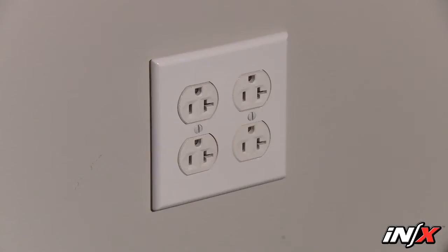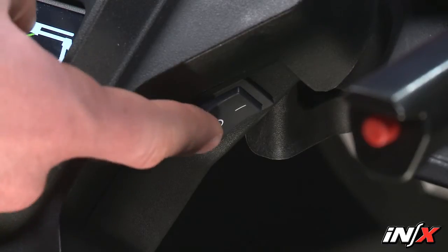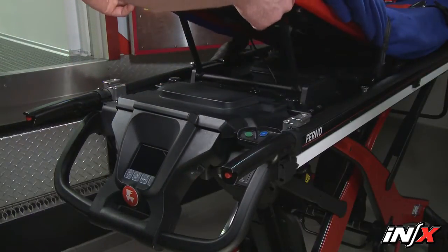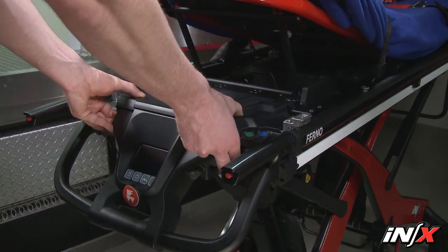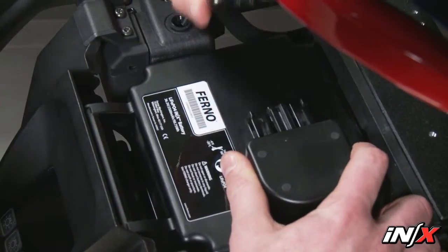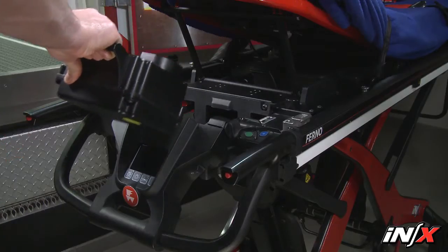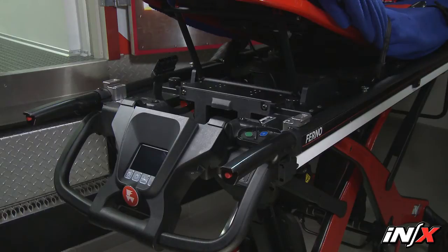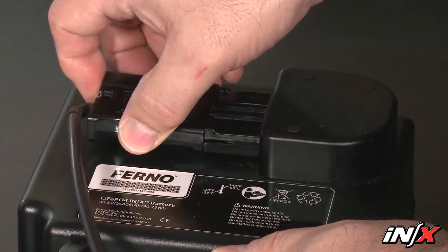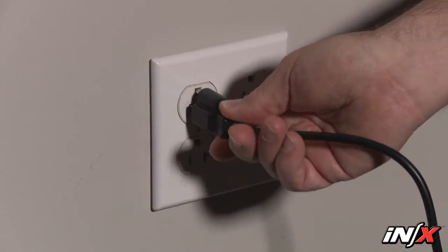To charge the battery through a household electric outlet, make sure the NX power switch is in the off position. Remove the battery from the NX by lifting the shock frame and removing the battery cover. Grasp the battery cable plug and disconnect the cable from the battery port. Use the battery carry handle to lift the battery up and away from the cradle, and connect the battery adapter cable and battery charger to the NX battery. Then connect the battery charger to an electric outlet.